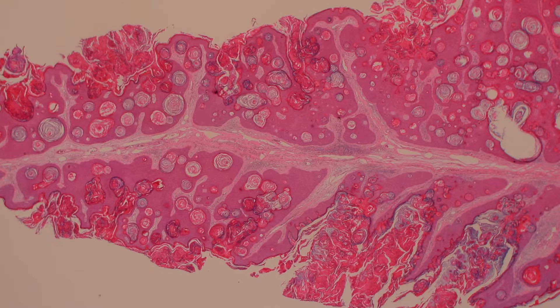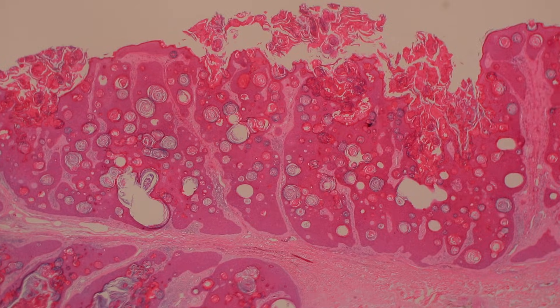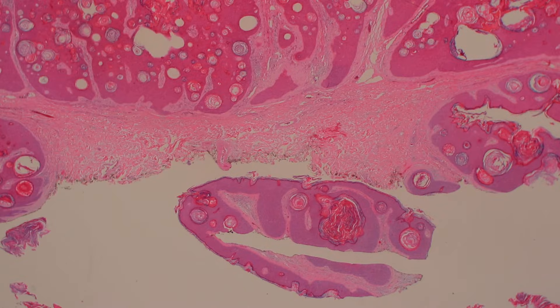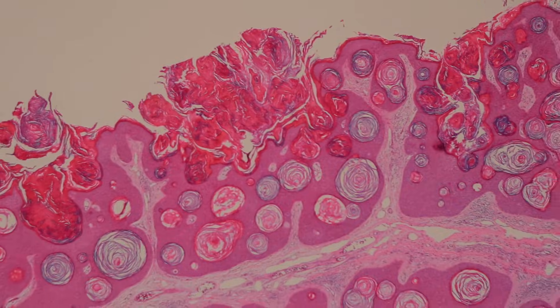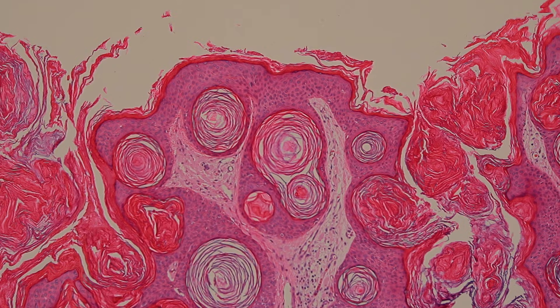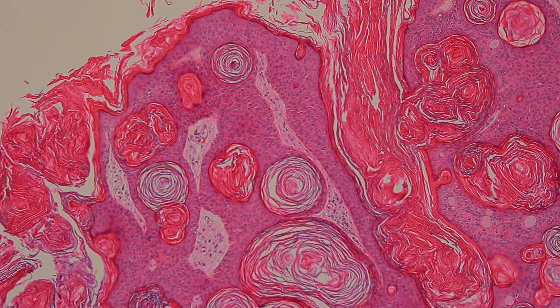This one doesn't show anything special except that it's just the biggest, most awesome example of seborrheic keratosis ever. This is a 2x objective — I can barely fit this thing in here, it's such a huge seb. You can see the normal skin would have been down here; it's sitting on a stalk and protruding up above the skin surface. Look at those horn pseudocysts! You can take a simple basic lesion and still find interesting stuff about it — and that is the joy of being a pathologist.